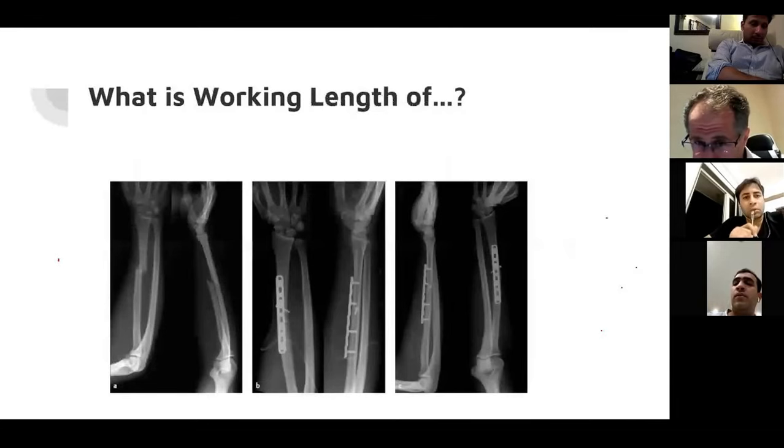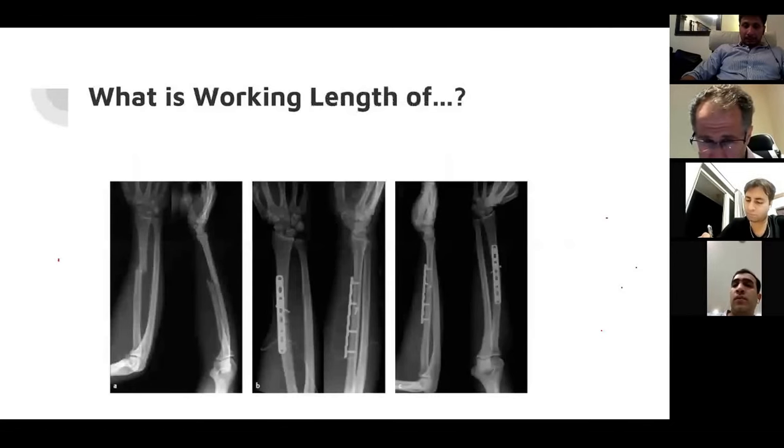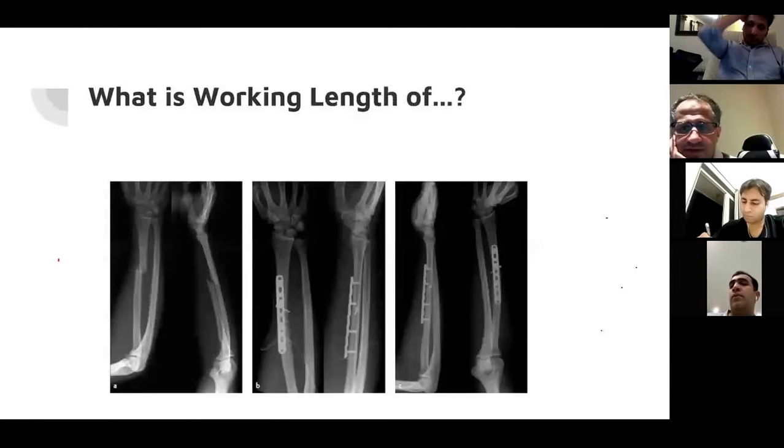Yeah, so I could see 3 X-rays in this. The first X-ray radiograph shows the fracture of the radius. Anything about that pattern? In both AP and lateral view. Yeah. So this seems to be a short oblique. Okay, good. Short oblique. Yep, brilliant.